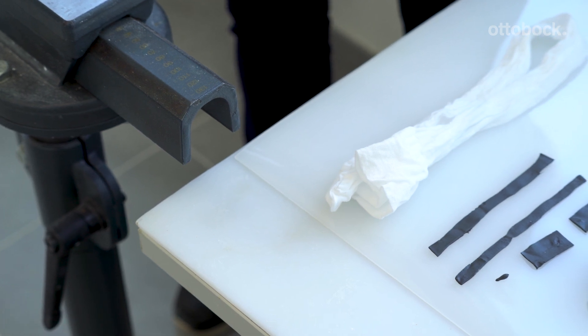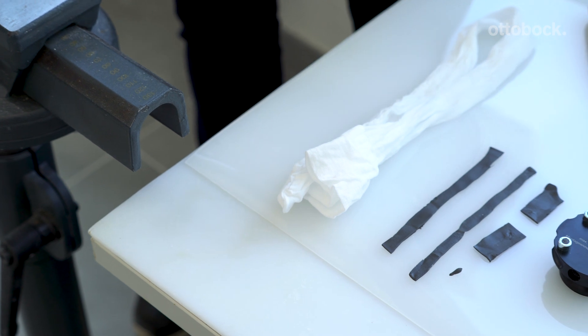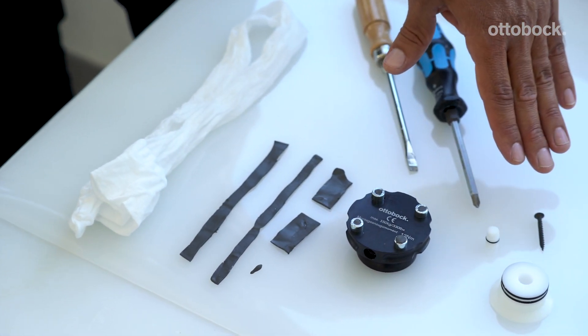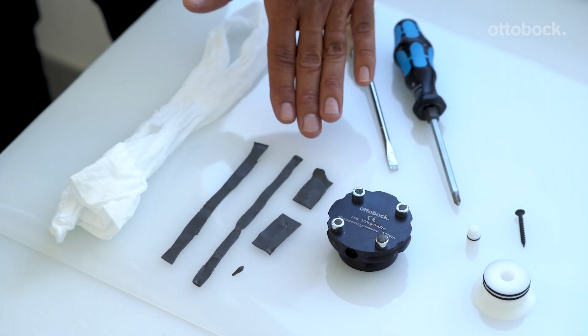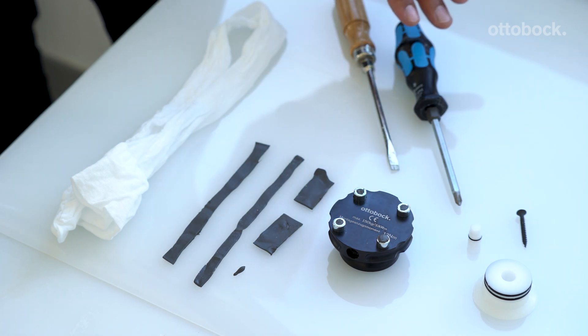Hello, in this video we will show you how to fabricate the check socket. You will need the following materials and tools: the DVS piston dummy, the valve, the DVS units, Plasta band, a 99B25 nylon, and these hand tools.